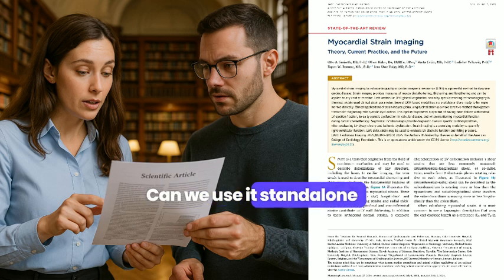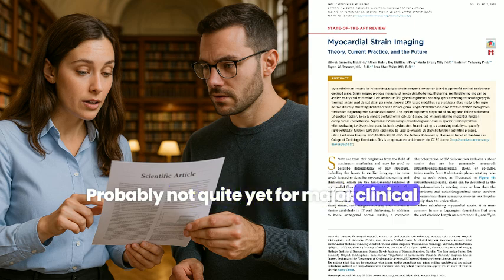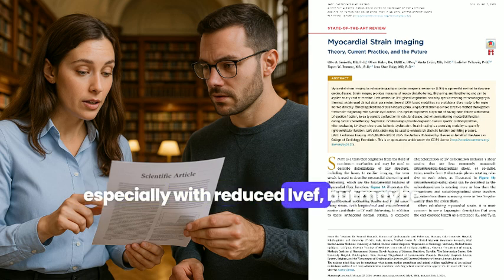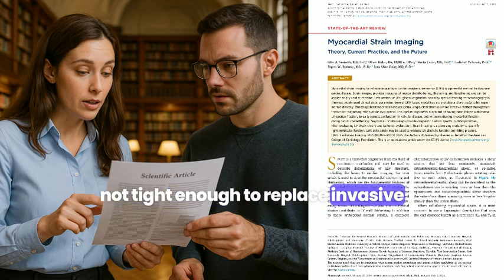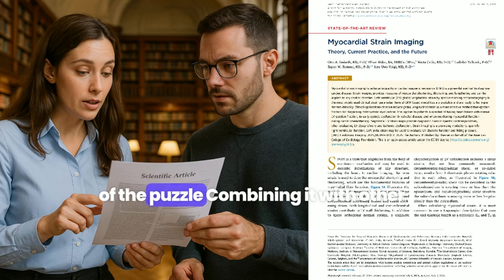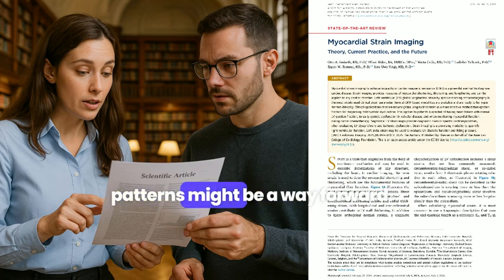Can we use it standalone to determine filling pressure? Probably not quite yet for major clinical decisions. The association is strong, especially with reduced LVEF, but maybe not tight enough to replace invasive measures or a full diastolic assessment. But it's a very valuable piece of the puzzle. Combining it with other parameters like mitral inflow patterns might be the way forward.